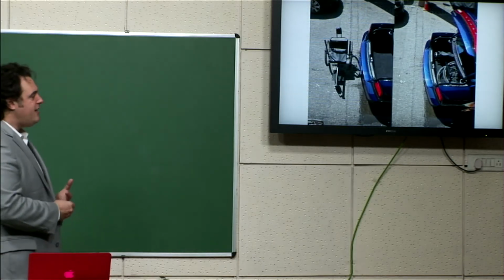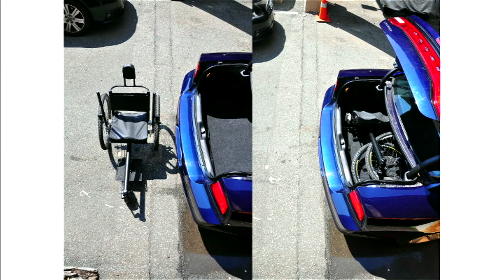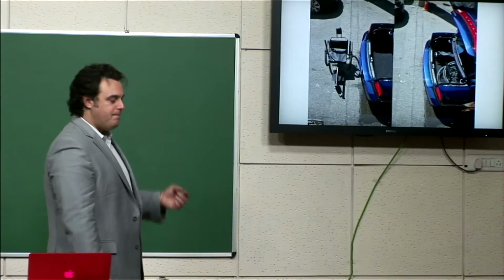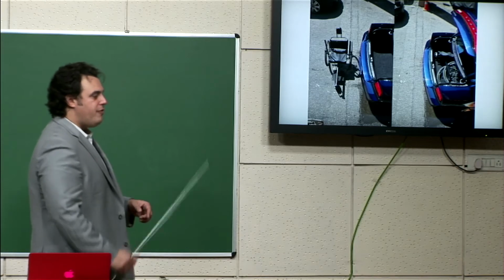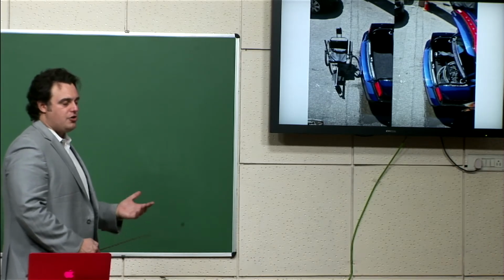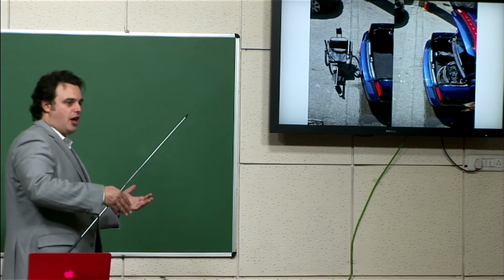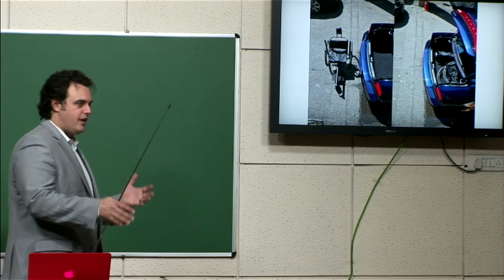What came out of this study as well was mapping out actual features we had to include in the wheelchair to make it suitable for users in countries like the US. The biggest one was portability. In countries like India, we found that most of our users, particularly in the village area, did not travel in cars on a daily basis. If they had to go in a car or bus, they could put the wheelchair on top and it was okay. It was a reasonable way to transport.